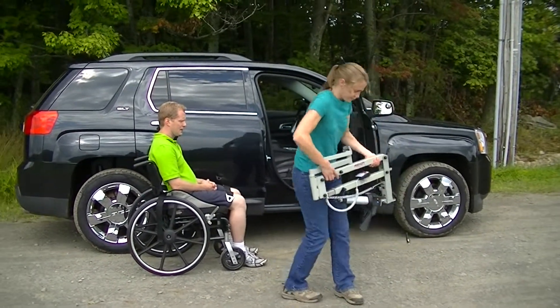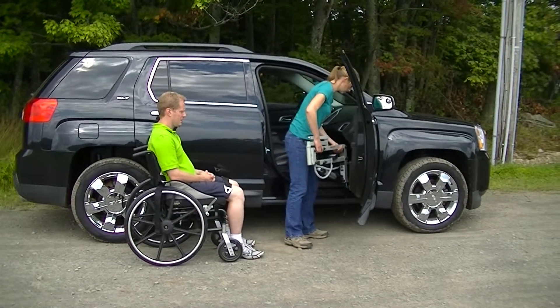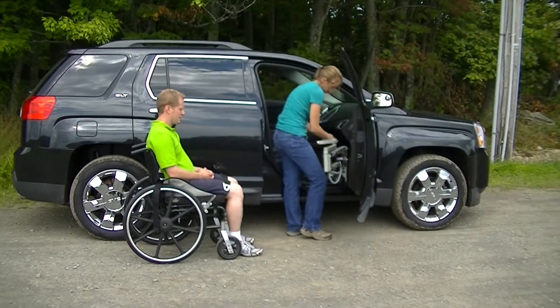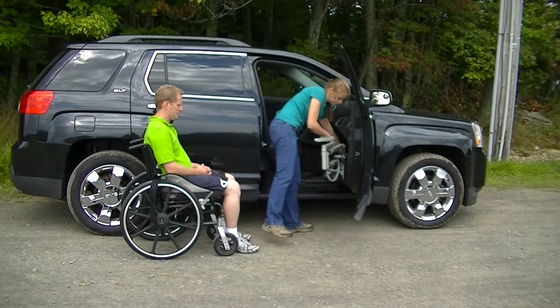I'm going to take the multi-lift and that's going to get set right on the pins. Power, in this case, is going to be a portable battery I'm plugging into, so we don't have to modify the vehicle at all.